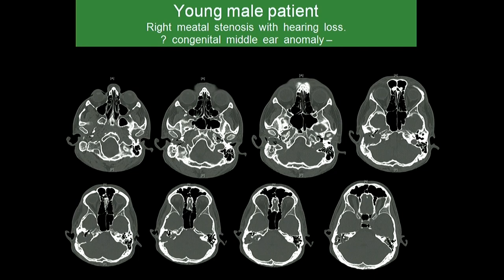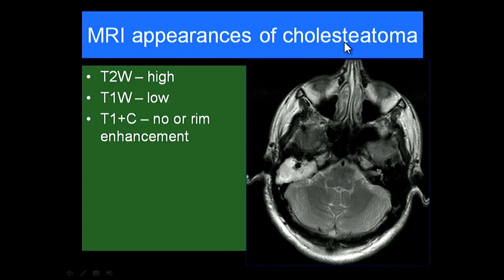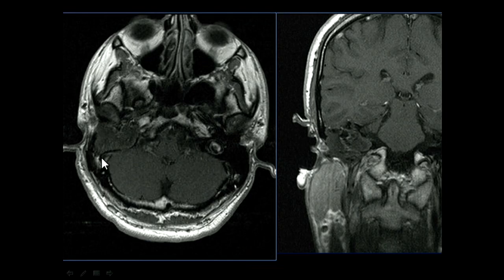A young male presented with meatal stenosis and hearing loss, initially thought to be a congenital middle ear anomaly. There is a large lesion within the right mastoid and middle ear going everywhere — the final diagnosis was congenital cholesteatoma. We also performed MRI: cholesteatoma appears as high signal on T2, low signal on T1, does not show enhancement following contrast because these are non-vascular epithelial cells, and sometimes shows a thin rim enhancement due to marginal granulation.